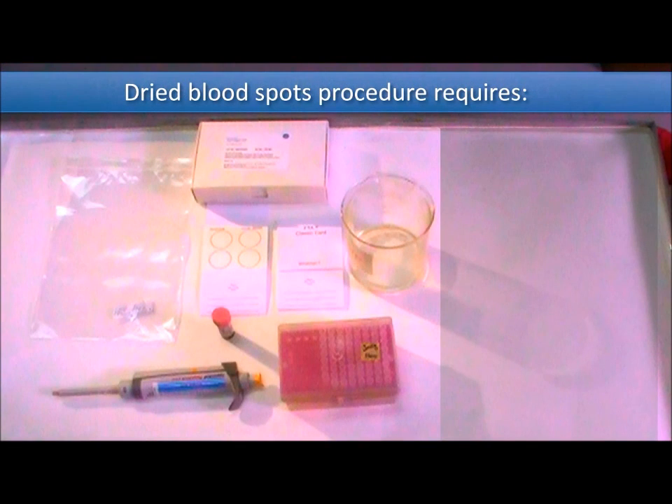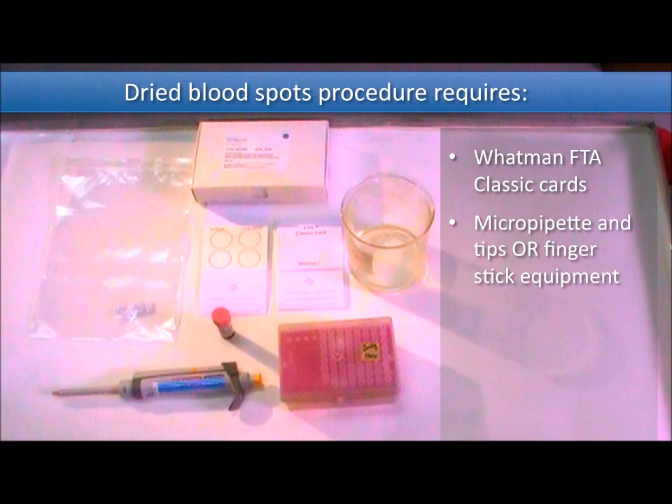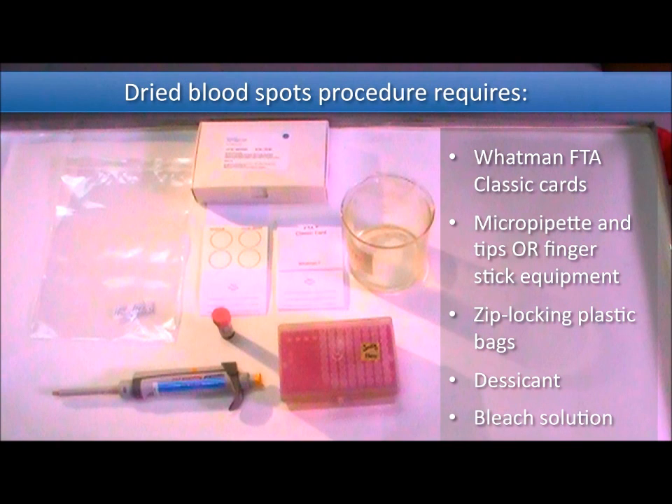This procedure requires Whatman FTA classic cards, 200 microliter pipette tips and micropipette, or equipment for a finger stick, zip-locking plastic bags, desiccant for storage, and bleach solution for waste.